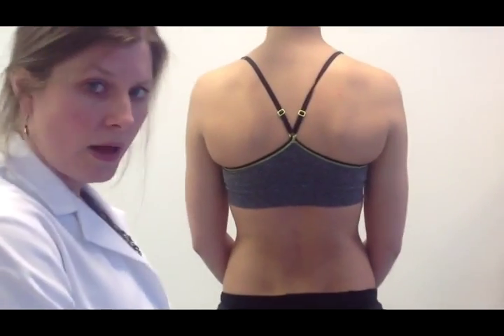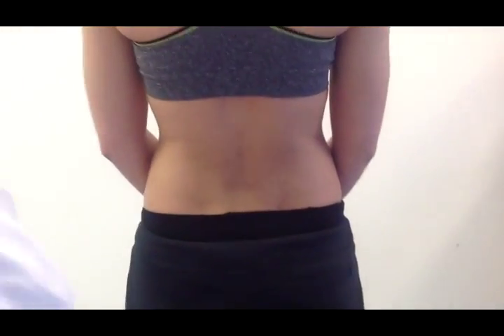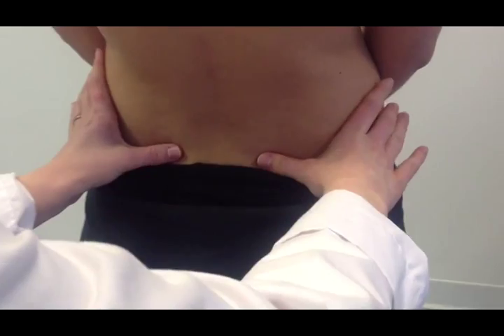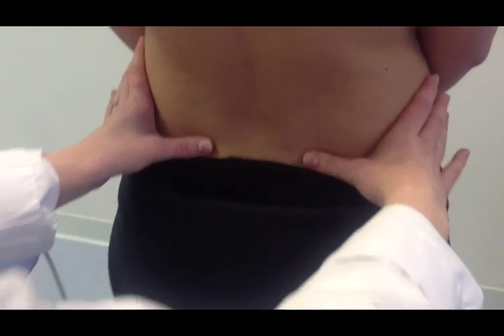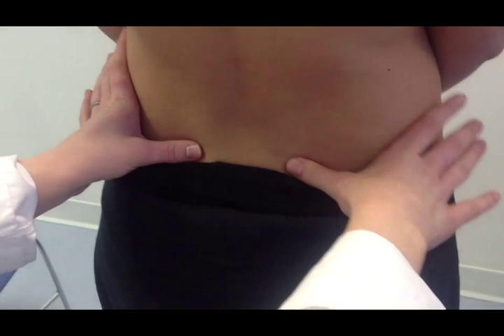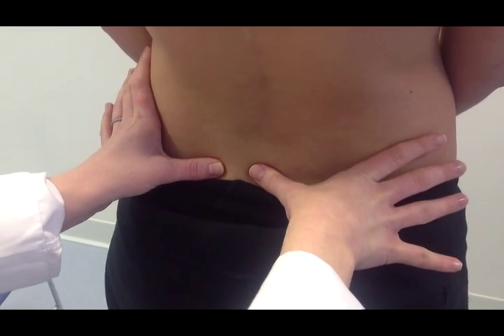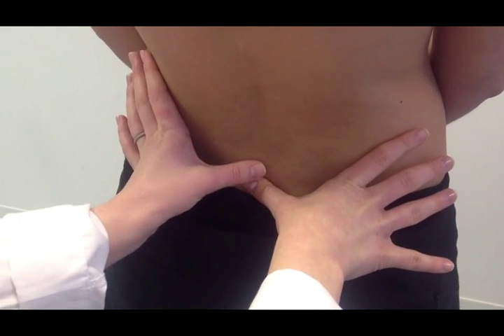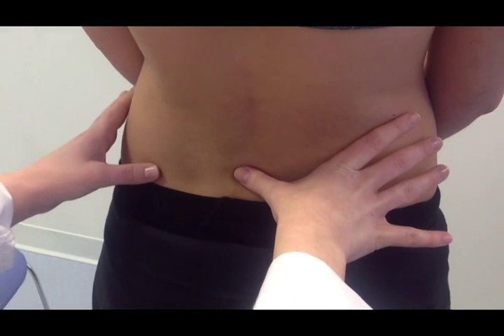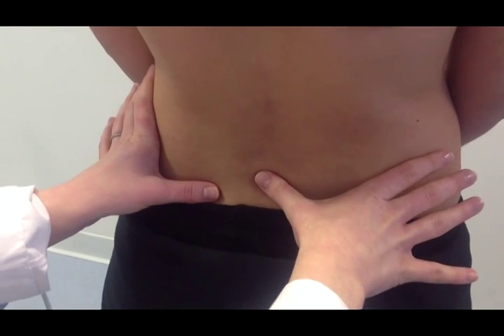A good way to find S1 is to start by palpating the PSISs. Once you've located your PSISs, directly in the middle is S2. To locate S1, you want to palpate up one vertebra from there. Once you've located S1, make note of it — that's where you're going to be placing your first inclinometer.